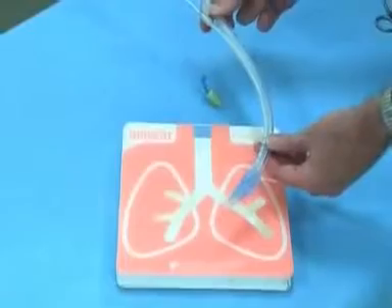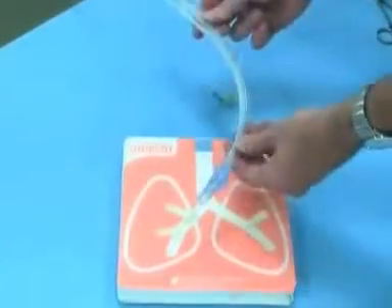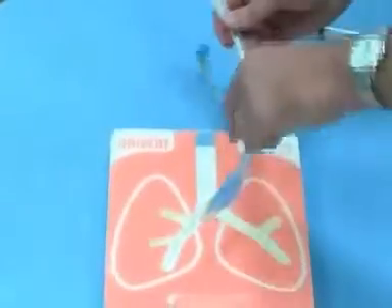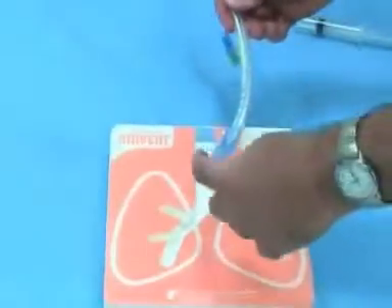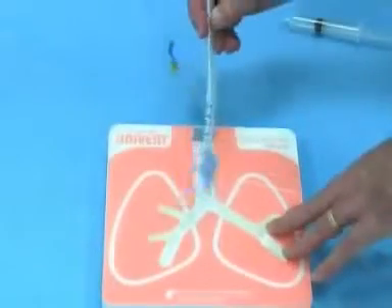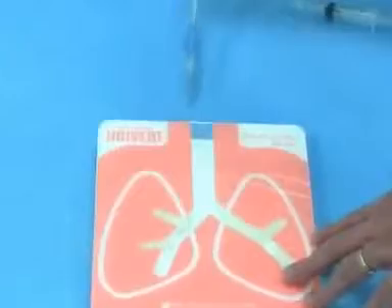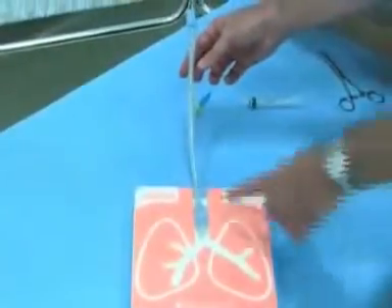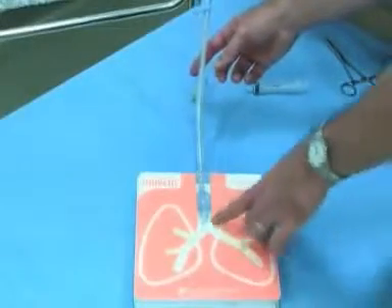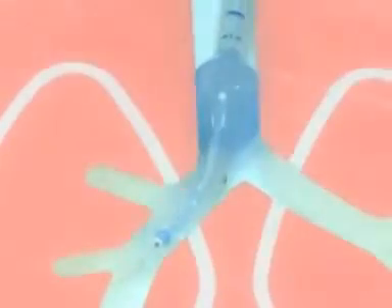The Univent tube is another way to isolate the lung — basically a regular endotracheal tube with a bronchial blocker built right in. The first thing you'll notice is that Univent tubes are pretty stiff, so you usually don't need a stylet. They're also kind of big and clunky — this is a 6-0 tube but it's almost like an 8-0. You may need to jimmy it a little going through the cords. Put the tube in to about 22 and inflate the cuff, make sure you can ventilate, then advance the blocker into the right side and inflate it — now you've blocked off the right side.